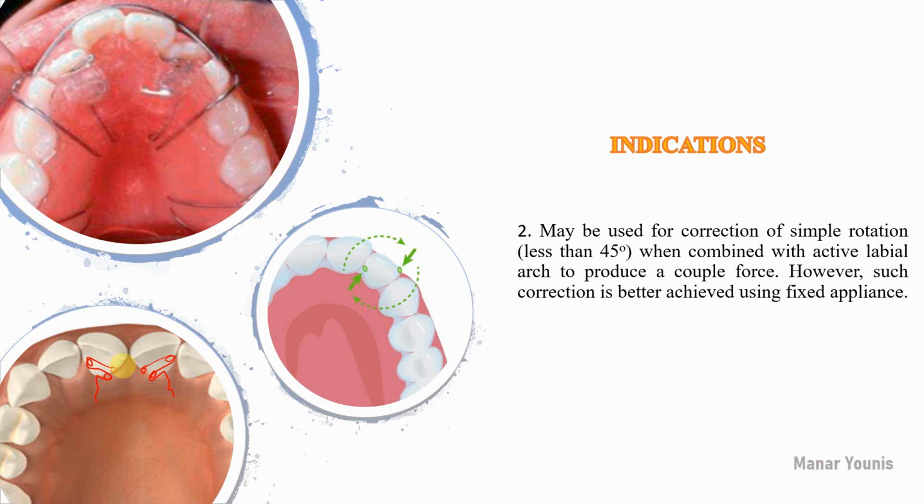Since there is mesiolingual rotation or distobuccal rotation of the tooth, the head should be placed at the mesial aspect. If the tooth is retroclined or in a crossbite relation without rotation, it will not matter whether you place the head of the spring on the mesial or the distal aspect.